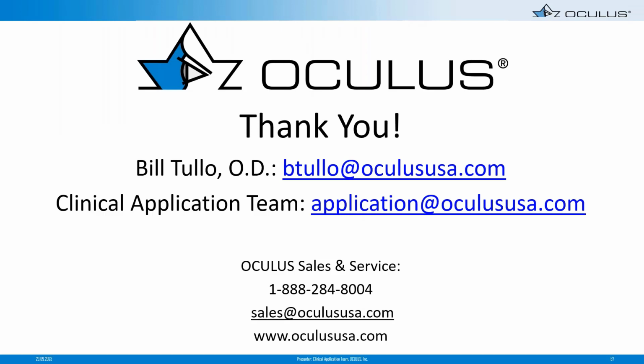Well, that's exactly the answer to the question. And first, we can talk about a category of lenses, soft lenses. We found in refractive surgery that soft daily wear disposable lenses, patients can be out of them for as little as 24 hours and have excellent, accurate scans. And other patients wearing different soft lenses like soft toric lenses or soft extended wear and sleeping with lenses, they can sometimes need to be out of the lenses as much as a week or more.